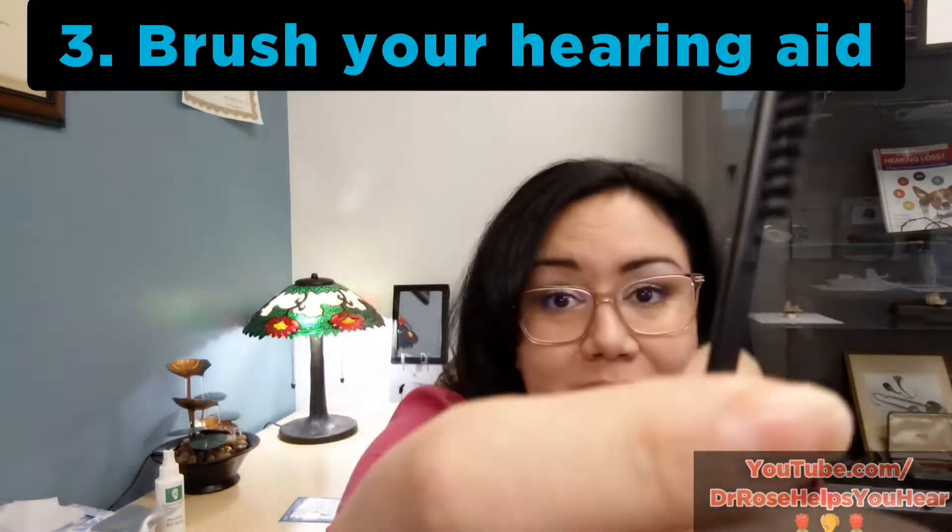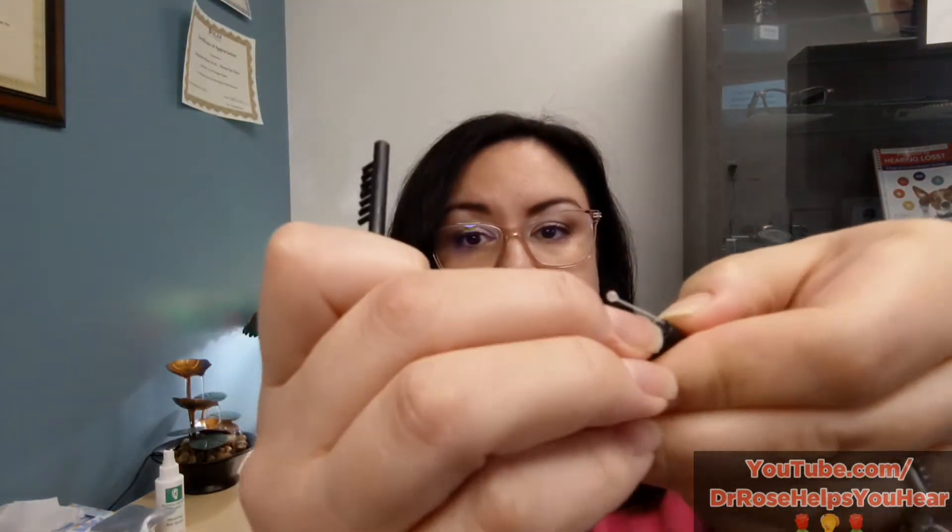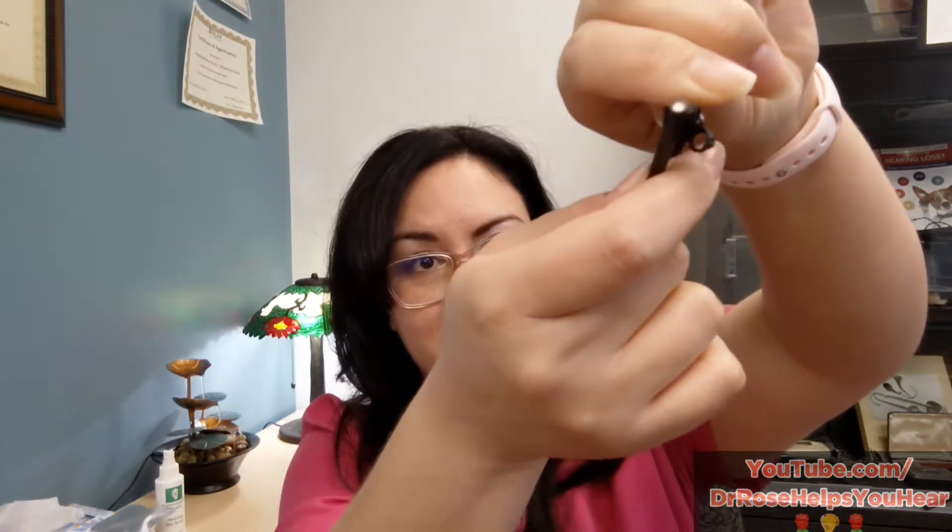If you've changed the filter and the battery and it's still not working, try giving it a simple brush. On invisible in-canal hearing aids, the microphones are sometimes tucked inside the battery door. Open the battery door, turn the hearing aid upside down — so debris falls to the ground rather than back into the hearing aid — and give it a light brush around that opening to dislodge any debris covering the microphone, because if sound can't get in, it can't get back out.